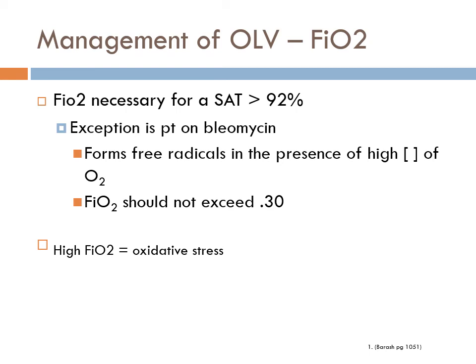So if they don't need 100%, don't give them 100% FiO2. The thought is if you give 100% FiO2, you have more of a threshold for when things go wrong because that's your whole FRC, right? What's the two volumes that make up the FRC? Capacities are always two volumes. And that's just your reservoir to take from. So you can still oxygenate without ventilating for so many minutes depending on the person. So in reality, run your FiO2 at a reasonable level that allows your oxygen saturation to be above 90 to 92. 92 I think is a better number to go with.